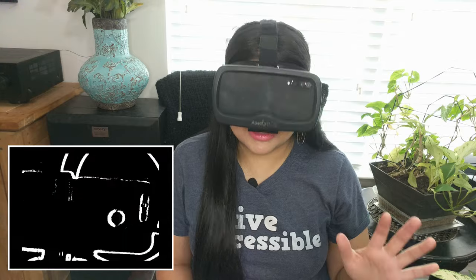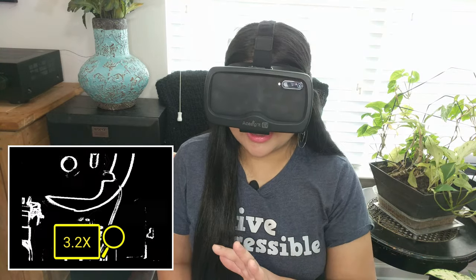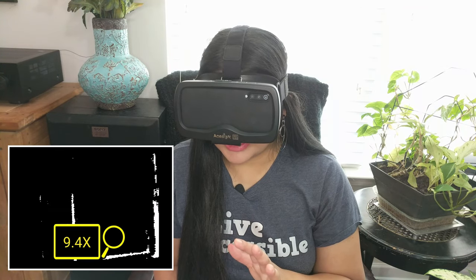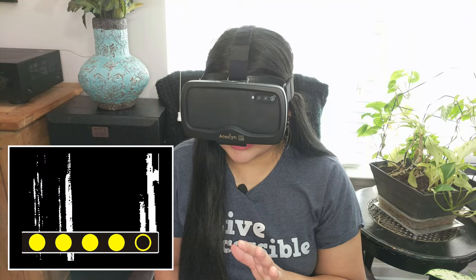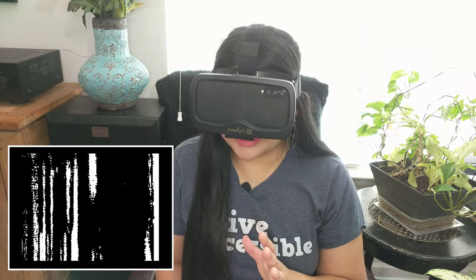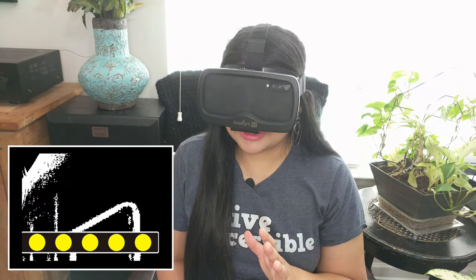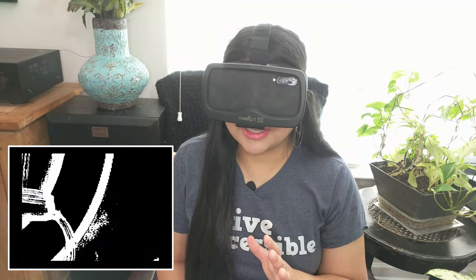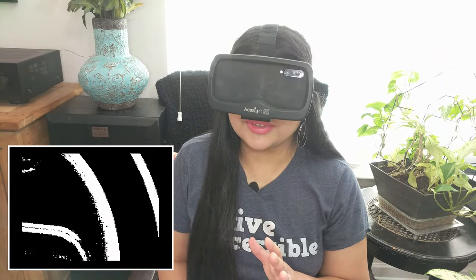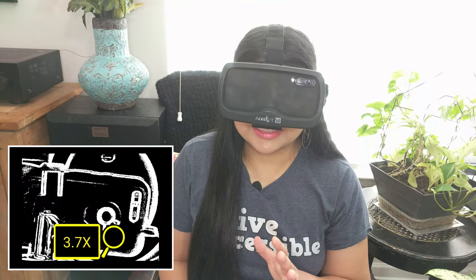After the regular color filter modes, it shows you an outline mode. So this is the white on black outline mode. And so you can see outlines here, and you can actually increase or decrease any of the color filters or the outline modes by going left and right with the joystick. Like that. And so right here, you can actually see the outline of my phone and the ring light that I'm using to record this video.